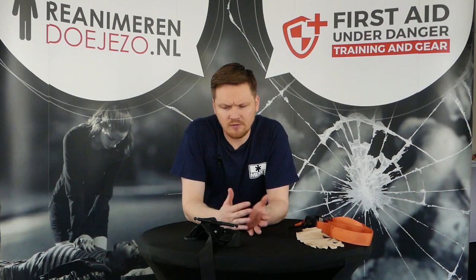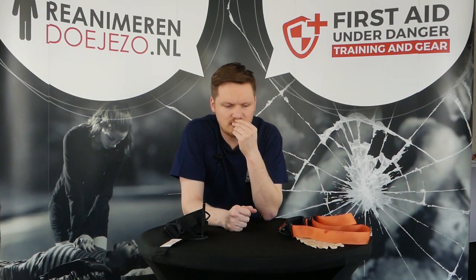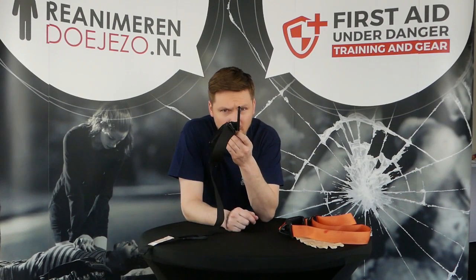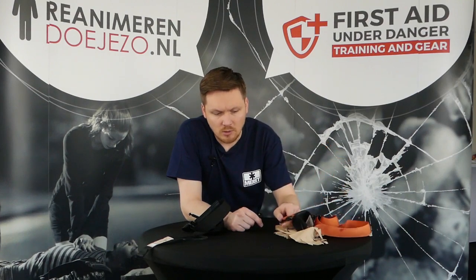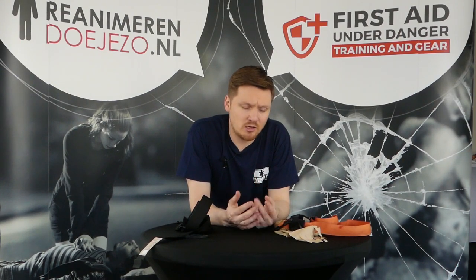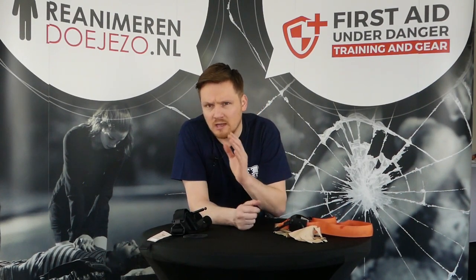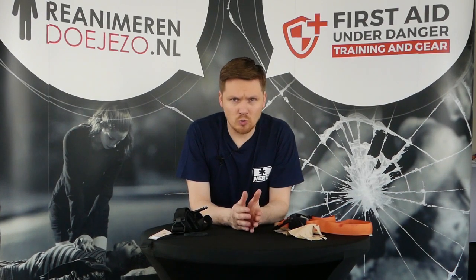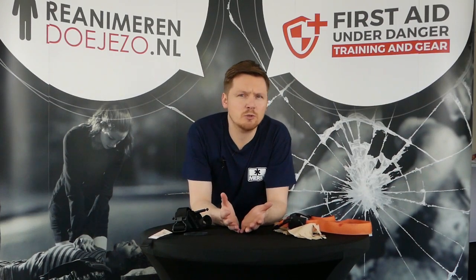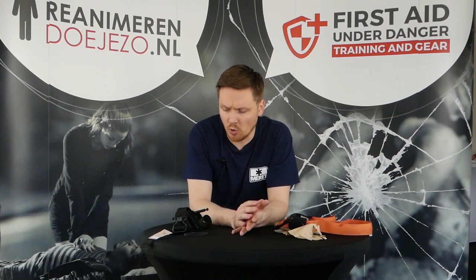Looking at the differences between the SOF Generation 3 and the SOF Generation 4, there are a few things that really changed. The tourniquet rod has become much narrower, smaller, thinner than the Generation 3. The pattern on the tourniquet rod has changed. And to my personal liking, I like the pattern of the SOF Generation 3 better than the Generation 4. But there could be evidence-based research that shows that this pattern just performs better in a pre-hospital setting. I need to check it for you, but this is just my personal preference and the things that I see now, getting it straight out of the package and showing it to you.